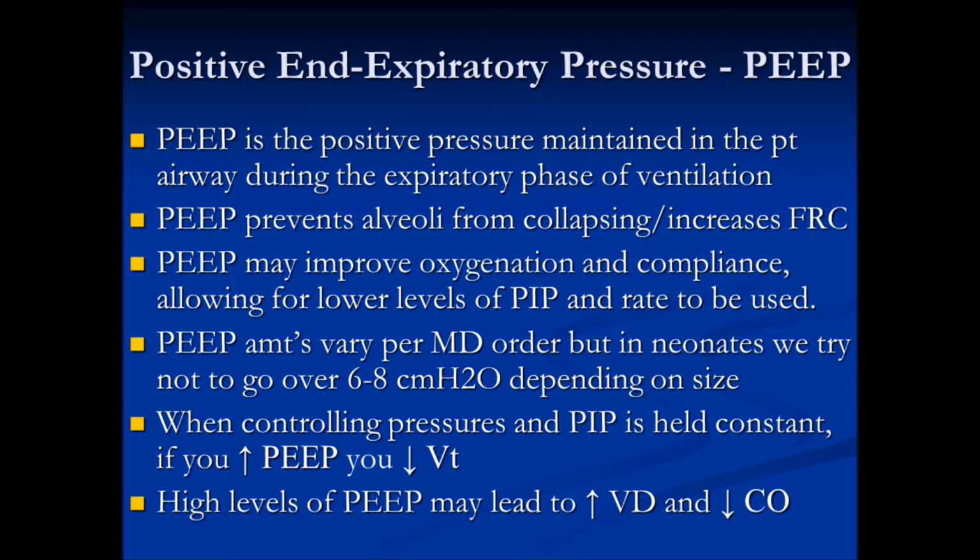So when controlling your pressures, if you are not manipulating your PIP, so PIP is held constant, if you increase your PEEP, you decrease your tidal volume. That should not be new information to you. This is all information that you've already learned when you were learning about adult ventilation and pressure control.